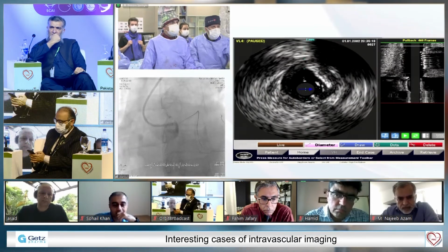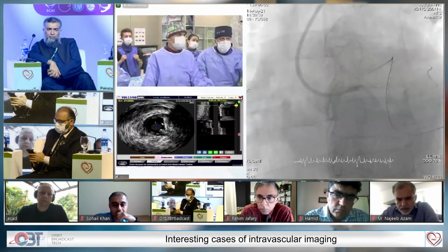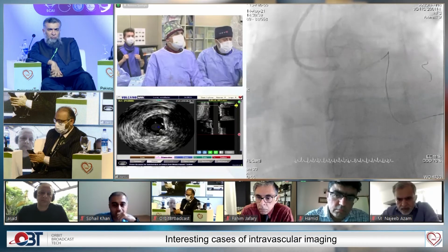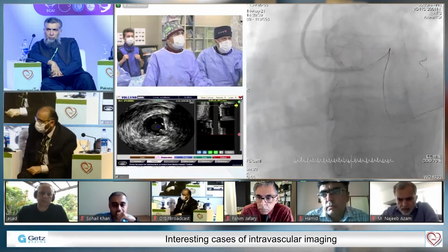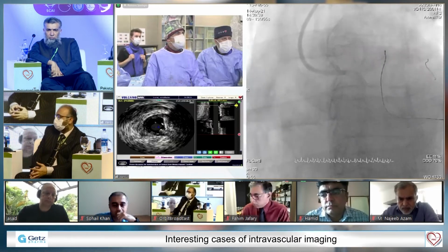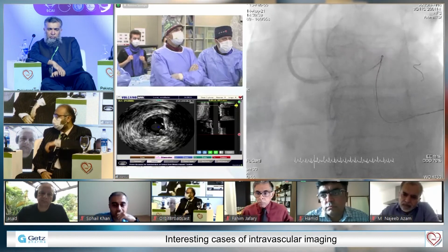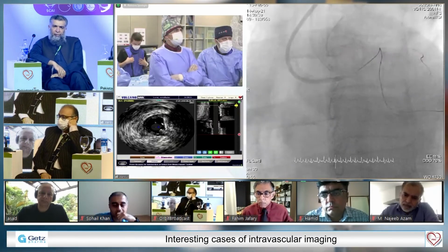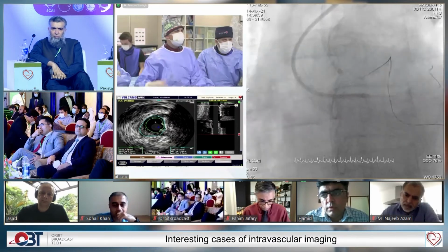In here, yes, this is the second EBU. It takes maybe 5 to 6 minutes to cross it. It wasn't easy. We just tried to engage the left main, and after some time, we were successful in inserting the wire. Anyway, next, please. Yeah, we did it.